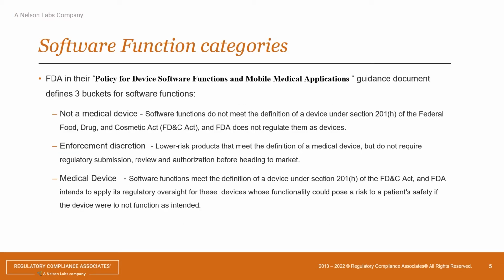Not long ago, 2-3 years ago, FDA came out with a guidance document on policy for device software functions. In that, they basically categorize these types of software in 3 categories. If it meets the definition of a device, then it's one thing. If it doesn't meet it, you just have to determine that up front. So if it doesn't meet the definition of a medical device, that it doesn't treat, cure, mitigate, or diagnose diseases, then it's not a medical device, and FDA does not regulate those devices.